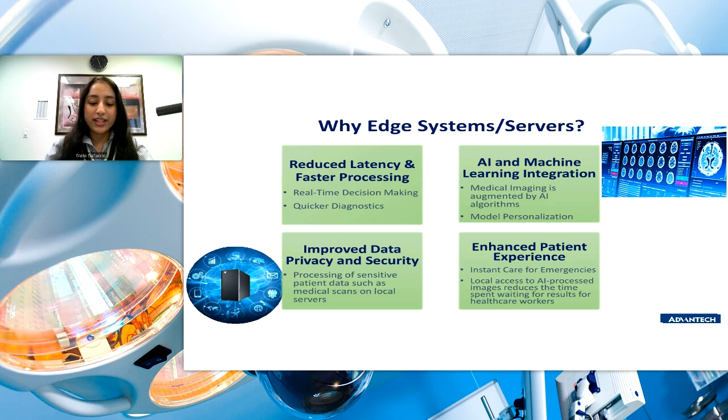Finally, AI and machine learning integration at the edge. Medical imaging is increasingly augmented by AI algorithms for tasks such as image segmentation, anomaly detection, and diagnostic assistance. Edge systems can run AI models locally, reducing the need to send data to cloud servers for processing, and this will enable quicker feedback for clinicians.